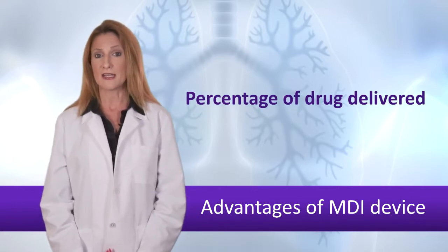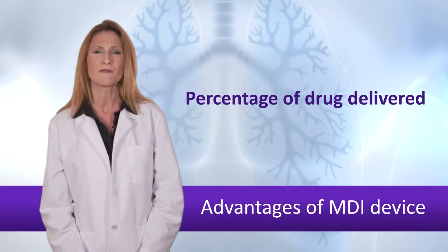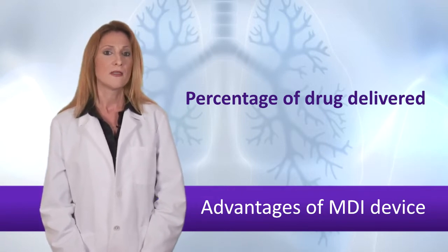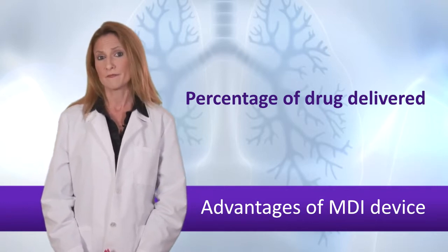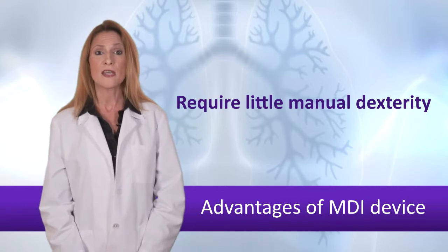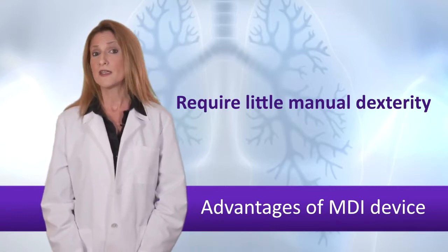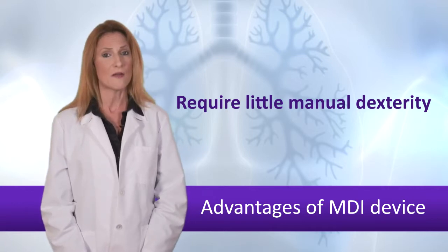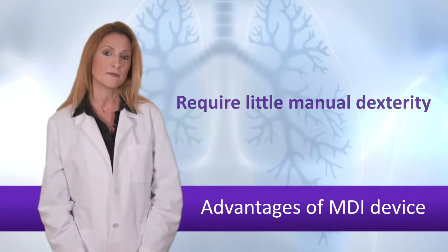With correct device technique, the percentage of drug delivered to the lung can be similar to nebulizers, about 15 to 20%. However, with some HFA formulations, drug delivery is much higher, more than 50% of the dose released. The doses in the MDI are self-contained. Unlike some of the dry powdered inhalers, loading of individual capsules for each dose is not required. This is helpful with patients who lack manual dexterity.